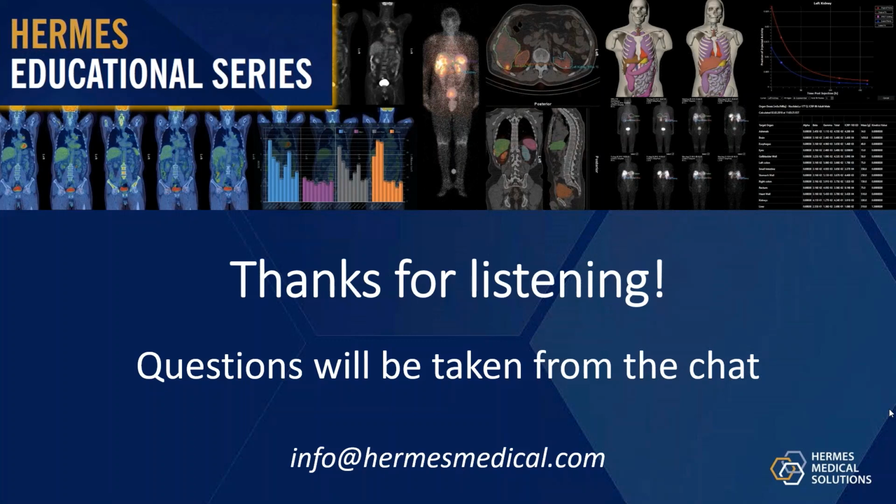That's right. That's actually already in the organ dosimetry package, because it relies on having drawn your region first, then it knows the volume. Yeah. And so if you've got a scaling that you know volume to recovery coefficient, then it can apply it then. It's a bit more of a tricky question to know how to apply that just to reconstruction without any regions drawn yet. But yeah, it's an important thing to consider when doing dosimetry for sure.